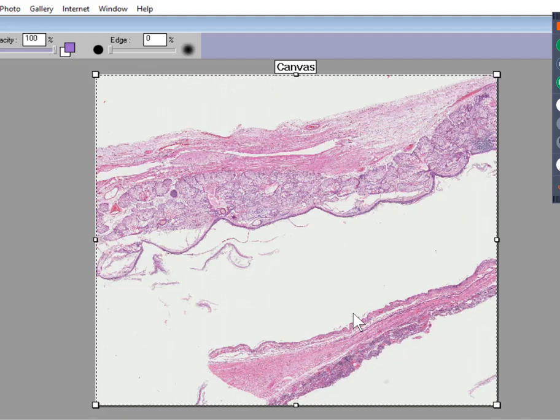Because remember, this is a teratoma. Technically, it's derived from cells which theoretically can differentiate into almost any type of recognizable human tissue. Not just epithelial, but also things like smooth muscle or bone, okay?